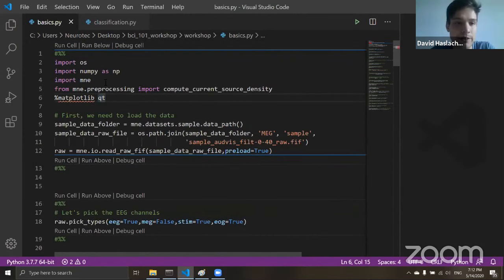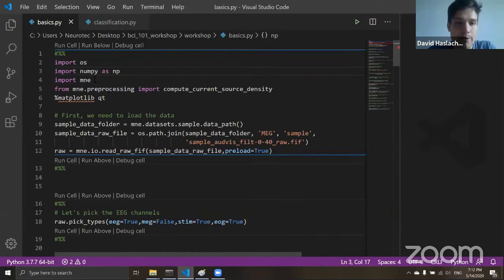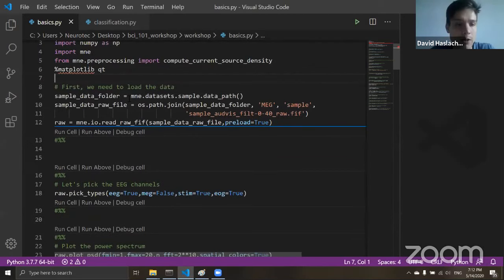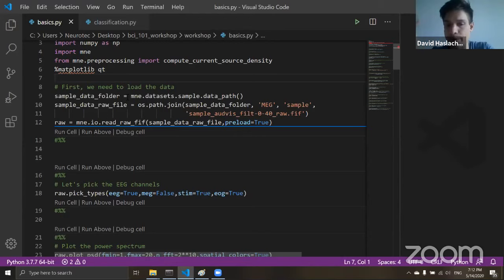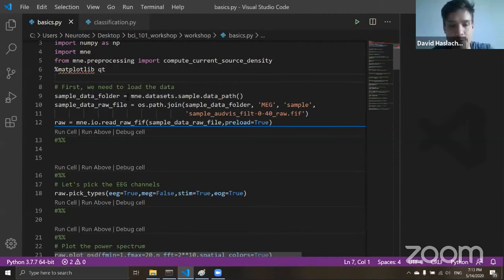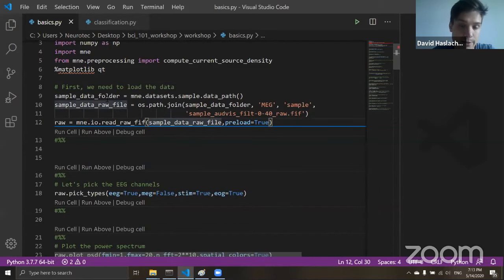At the very top, the first thing we do is import the MNE package and the NumPy package. MNE and NumPy are usually the first things we import. We're going to be examining a sample dataset on audio and visual stimulation. Basically, in this experiment participants were exposed to very simple visual and auditory stimuli — little beeps or blinks. MNE has a bunch of pre-packaged datasets integrated which we can easily download and open by calling these three lines of code.